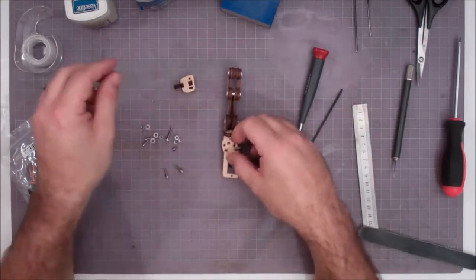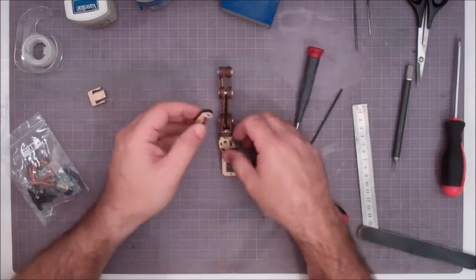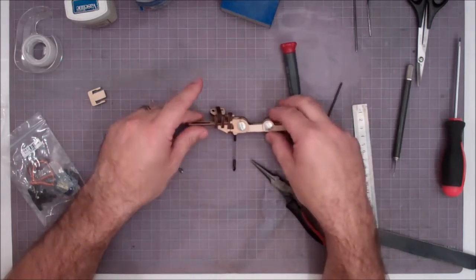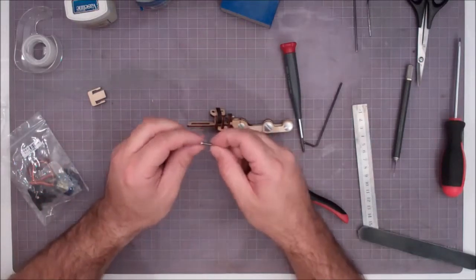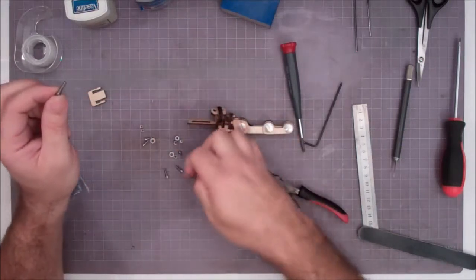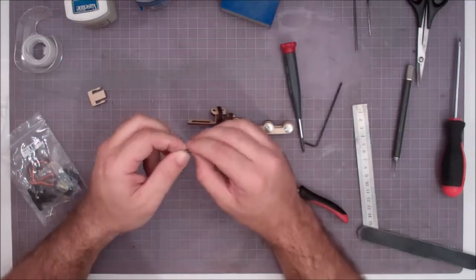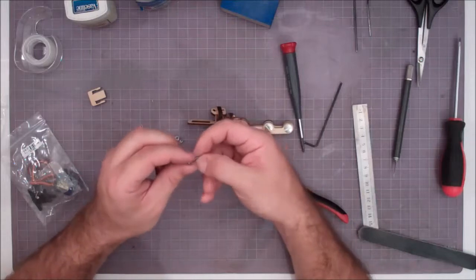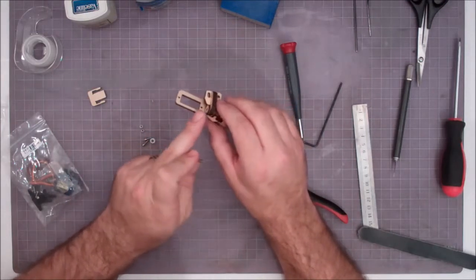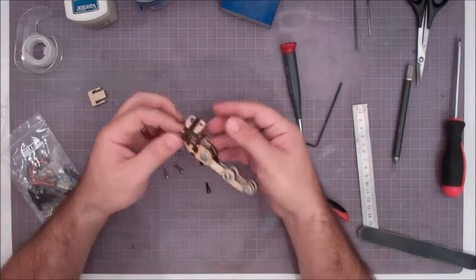Now, we want to take our base part of our thumb, which is our second portion that actually bolts it to the thumb, and this basically is assembled like this. This part slides in between those 2 tabs, and you line up the 3 holes. Now you'll find that you have a long 440 screw in there, plus some additional washers here. So you want to put your washer on the head side of your bolt. The nut itself is fairly large in diameter, so we don't run a washer on there. The washer goes on the head side, and it comes from the servo side of the tab. So you've got the servo side and the finger side. From the servo side, we insert that 440 bolt and pass it through those 3 sections.